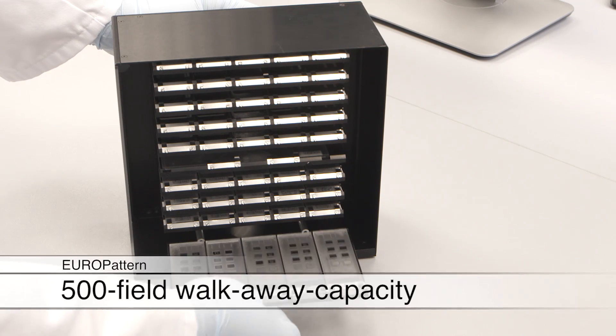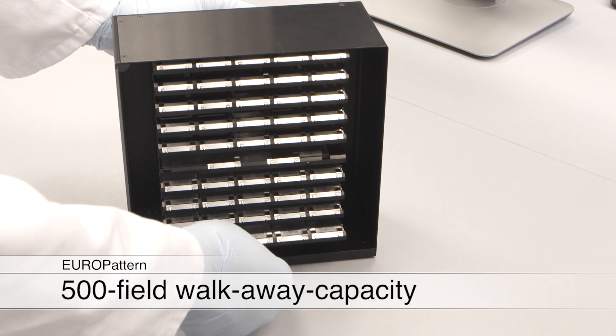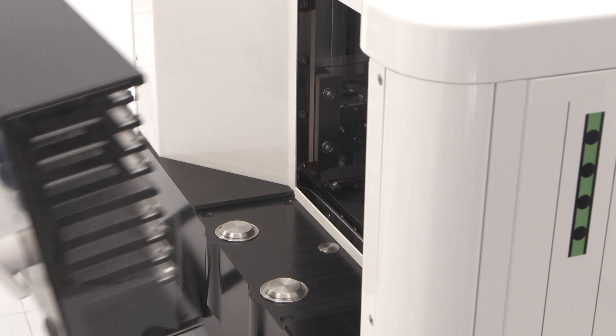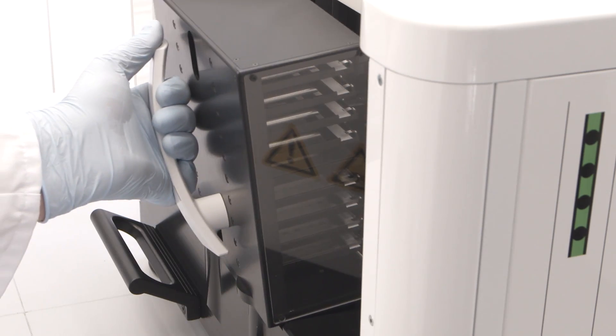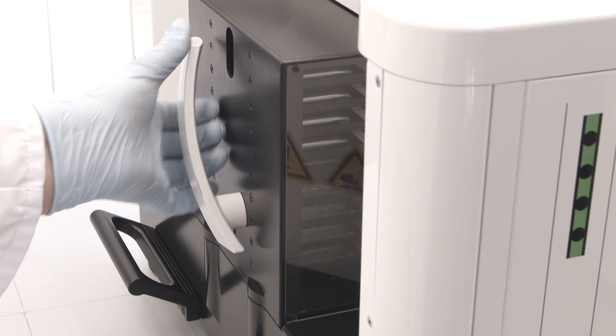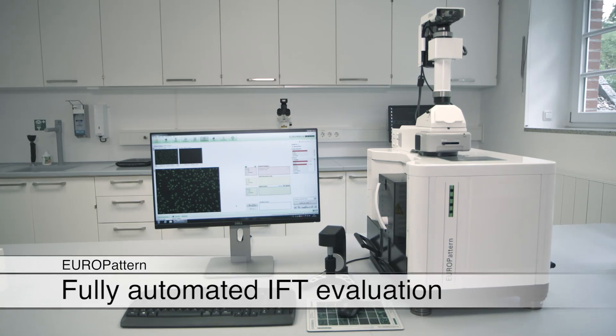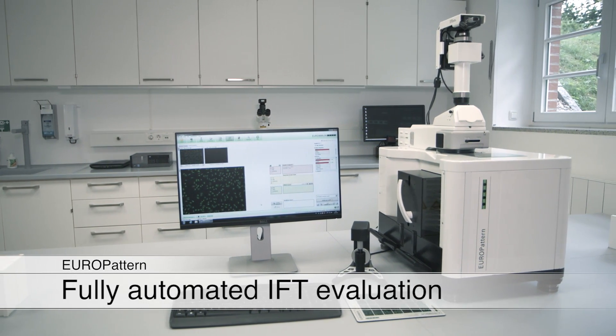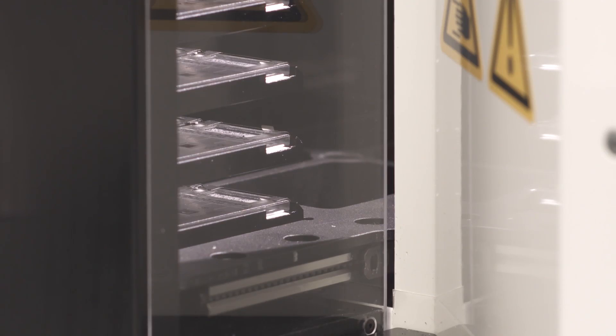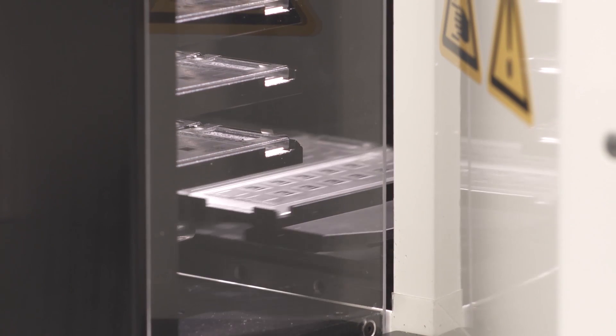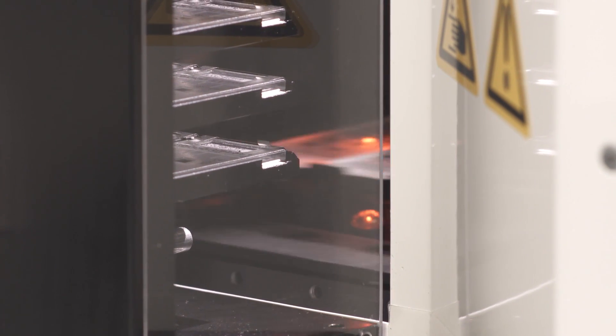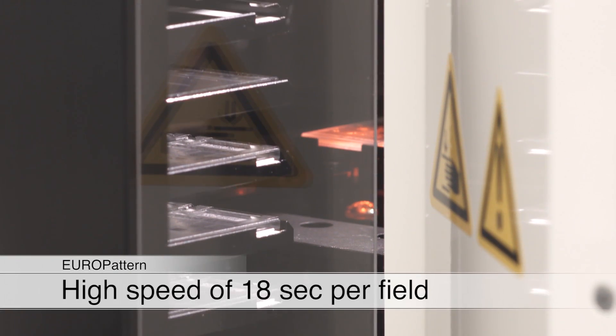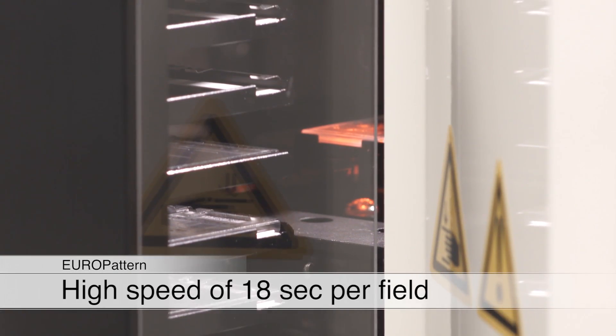For larger sample numbers, the object slides can be loaded into the Euro-pattern microscope magazine, which can carry up to 500 fields. Here, they are automatically identified and microscoped. This procedure ensures complete traceability of results.